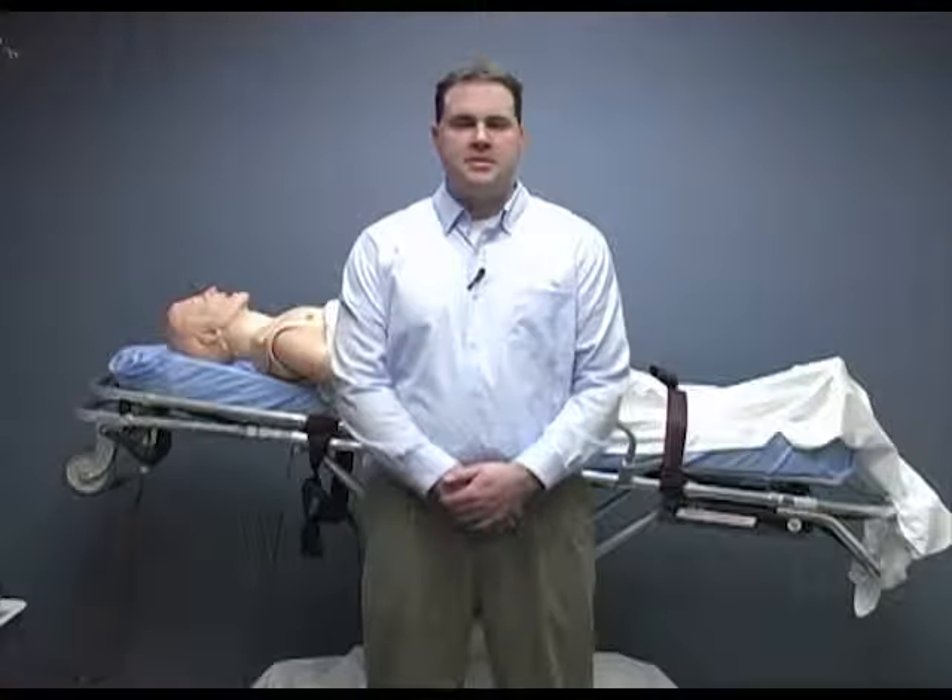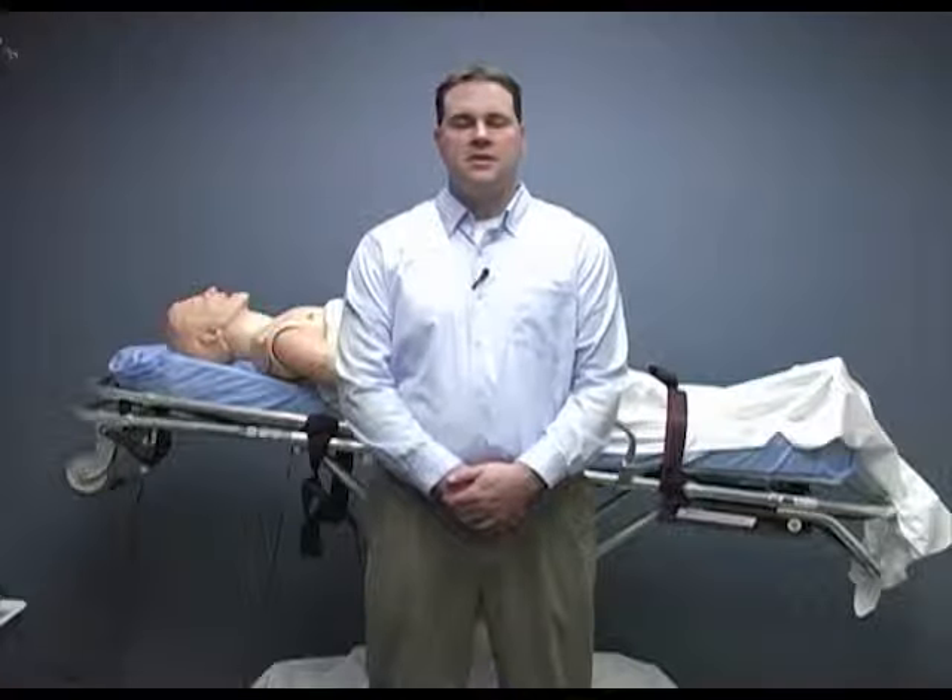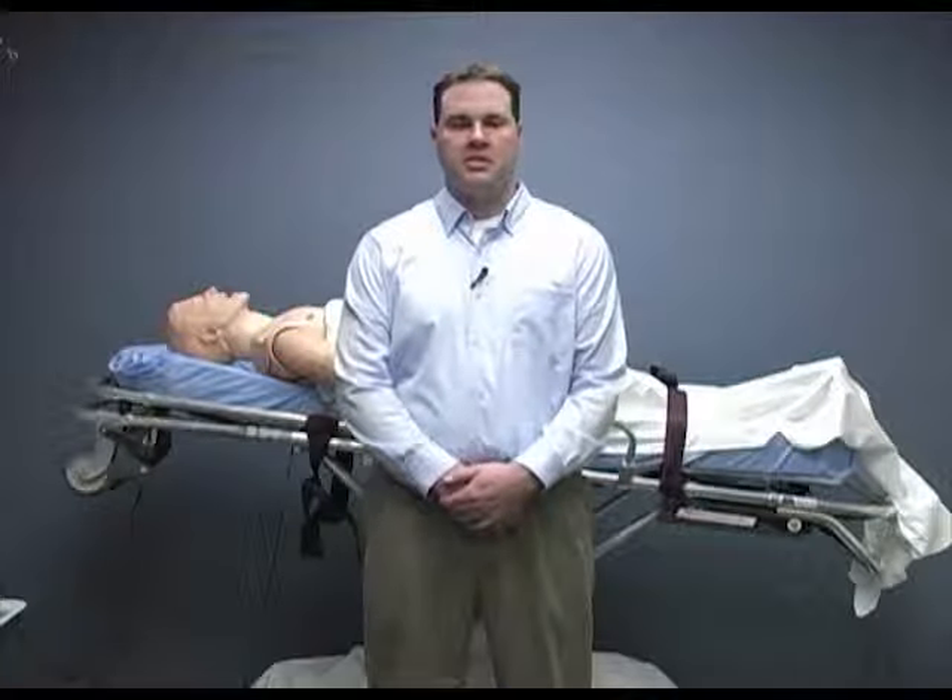Hello, my name is Travis Smith. I'm an instructor at HealthONE EMS and I'm here today to talk to you about the use of IV therapy and how to perform a venipuncture.